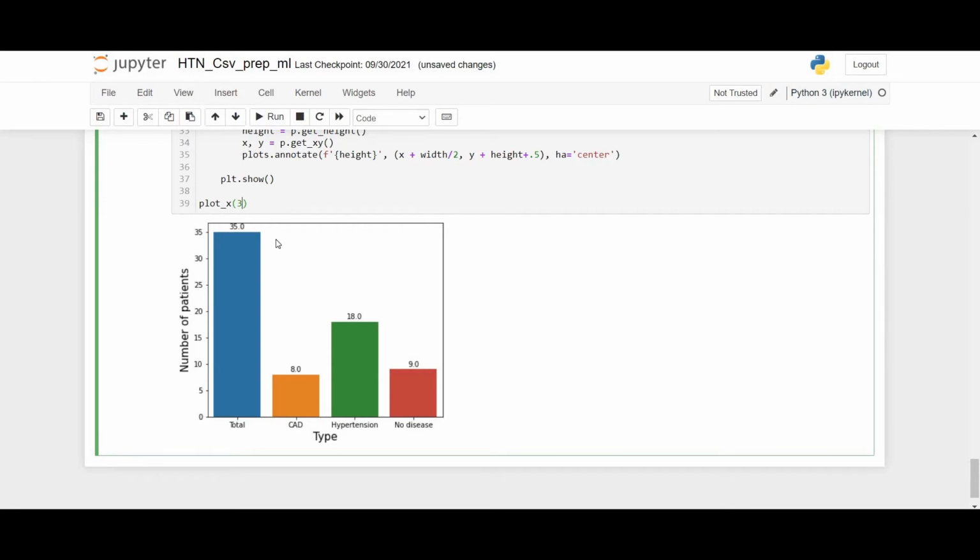To see the details of the last 100 patients, we can input the desired number in the plot_x function. This function will give us the bar graph of the last X patient data entered in the sheet.